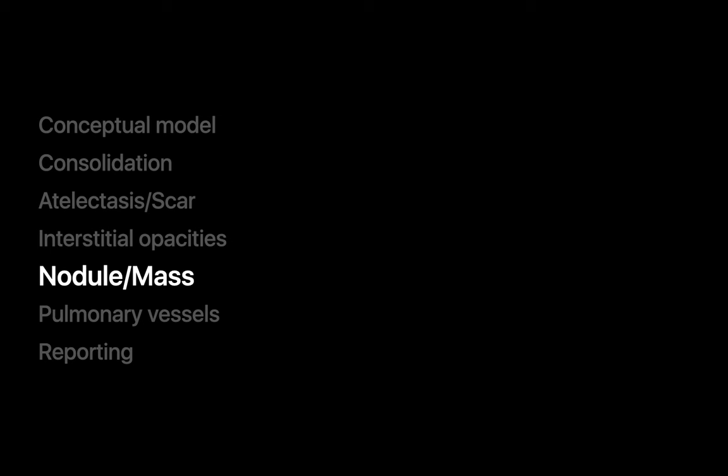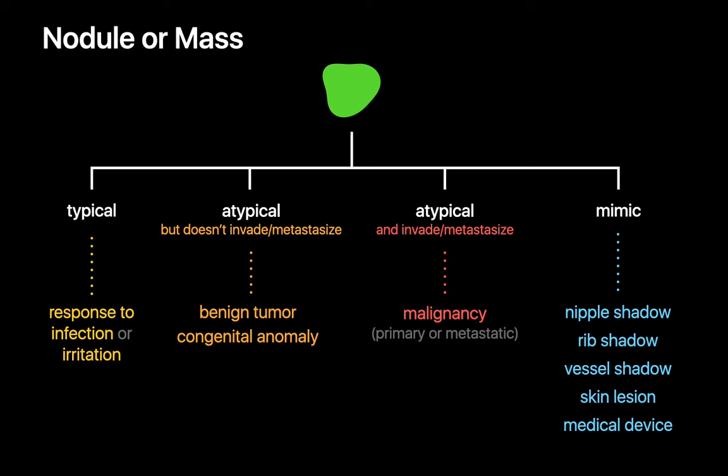Nodules or masses represent a lump within the lung parenchyma. We use three centimeters as the size threshold for differentiating a nodule from a mass. There are four explanations for an apparent nodule or mass on chest x-ray: a typical response to lung infection or irritation; an atypical proliferation of tissue, either benign congenital lesions or malignant tumors; or — perhaps most commonly — what we're actually seeing is a lung nodule mimic such as a nipple shadow, an overlapping rib shadow, a vascular shadow, a skin lesion, or a medical device like a plastic chest port.